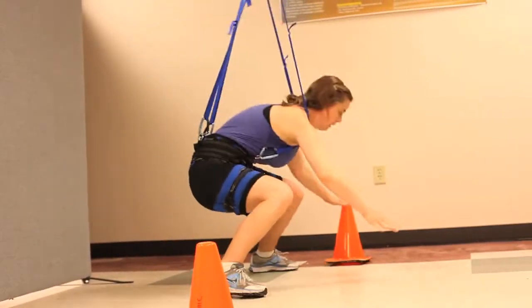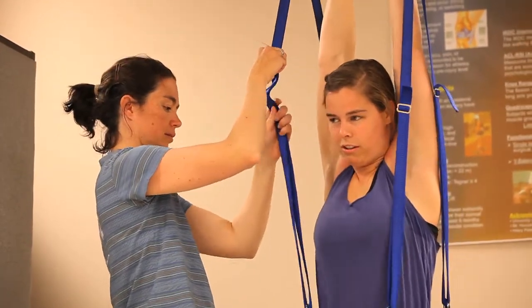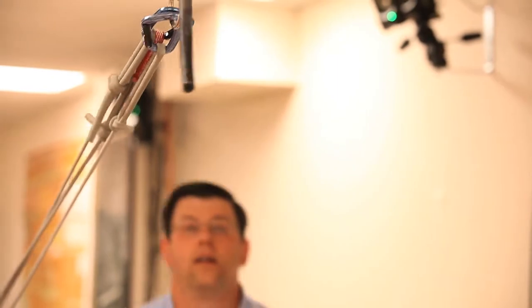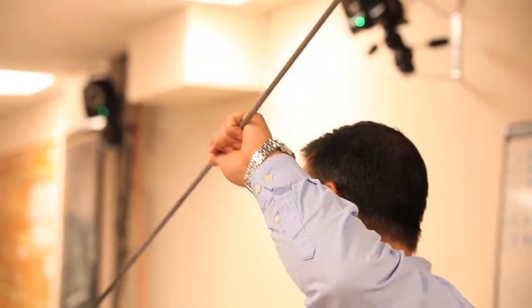We've developed a prototype for an unweighting system to allow athletes to feel more comfortable while they're retraining with jump tasks. We've collaborated with a group in Flora that has looked at trying to retrain athletes to do jumping, landing, cutting, pivoting, and really utilizing their knee again, which I think is a great application of where we need to go.